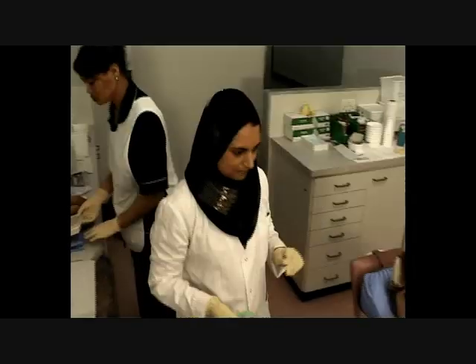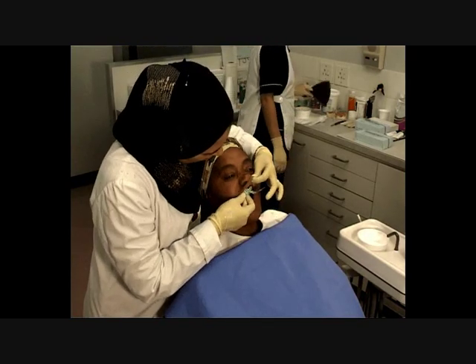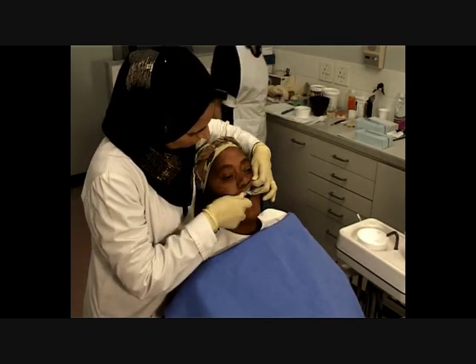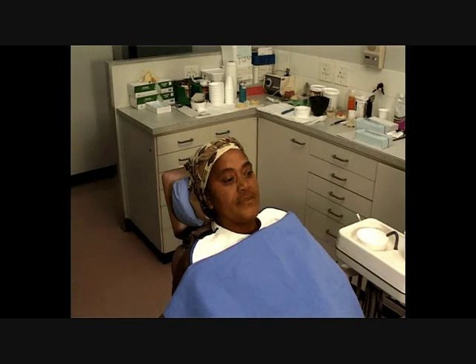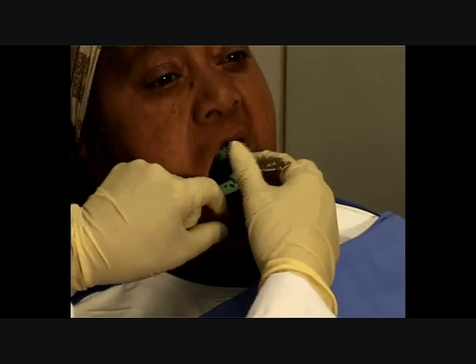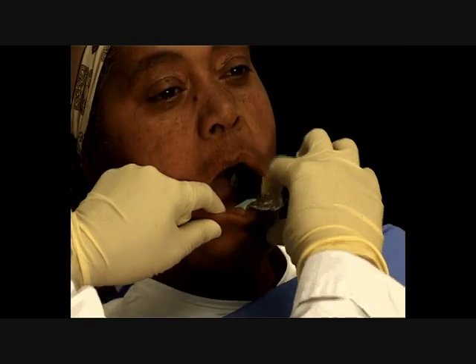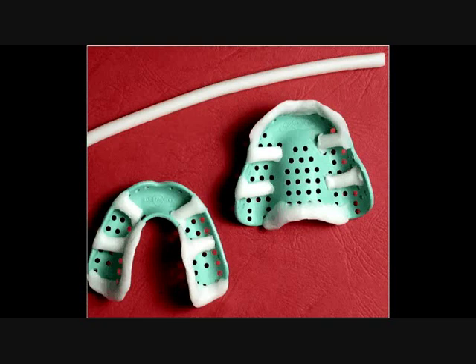Step 1. Select a suitable plastic or metal tray. Check the fit and extension of the tray in the patient's mouth. Ensure that the tray is capable of recording the entire alveolar ridge without appearing to impinge on the ridge or the sulcus.